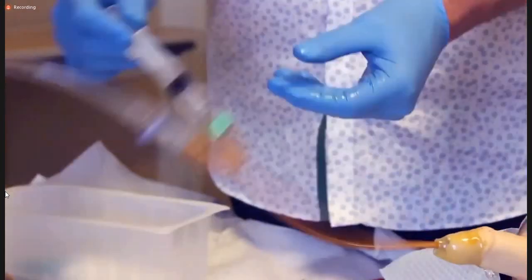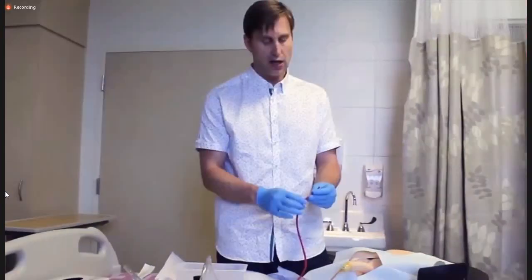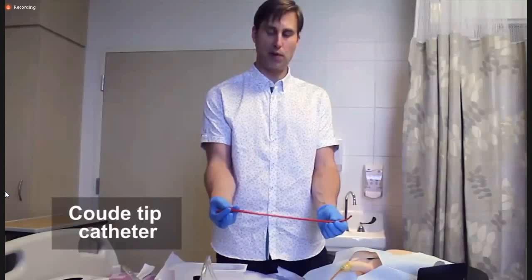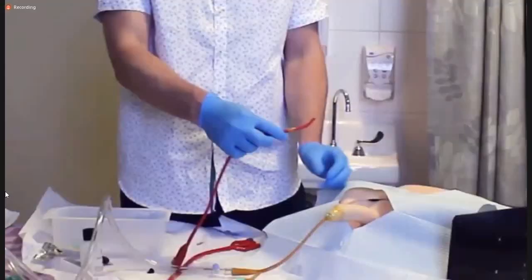Now, in some instances, you can encounter difficulties placing this catheter because of the angle of the urethra at the junction of the anterior and posterior urethra. So there is something called a coude tip catheter. And a coude tip catheter, simply put, is identical to a regular Foley catheter, except for one key difference. And that key difference is a curve.